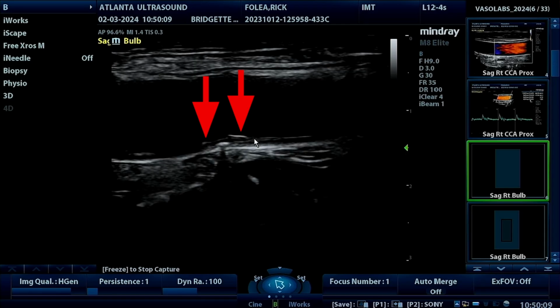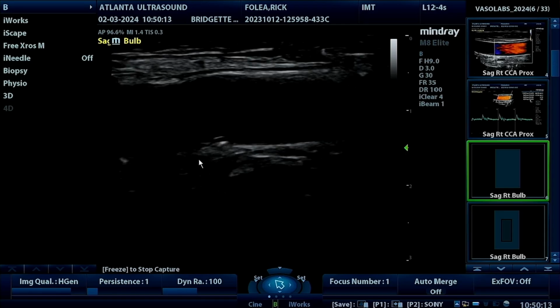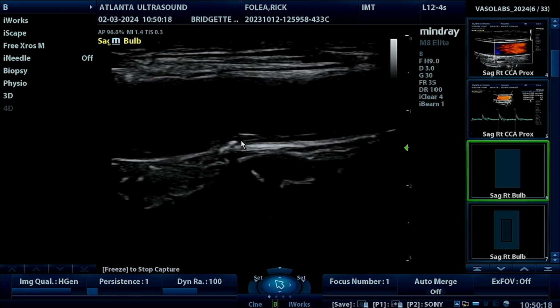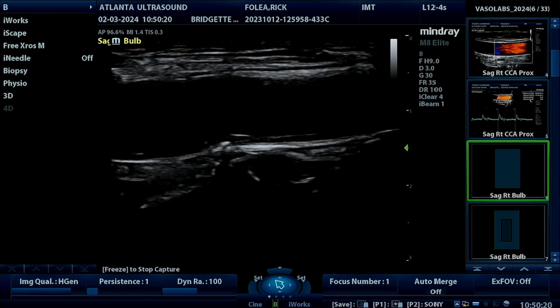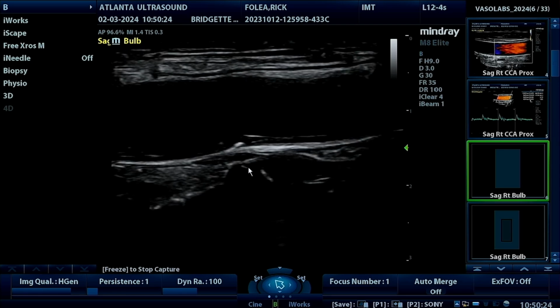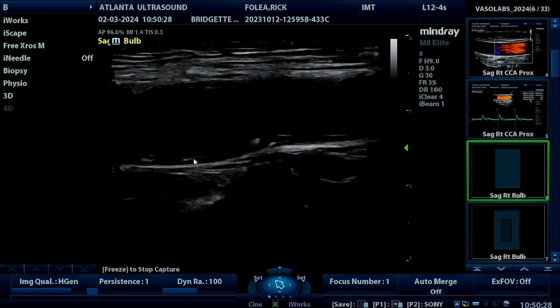These little plaques aren't casting a shadow, so we know these are more heterogeneous or mixed plaques. Or, I suppose it could be where the intima is starting to scab over and form a fibrous cap over the damage. Regardless, we definitely see the intima and media layers getting thicker, which tells us we definitely have plaque here. Not good news. Let's move farther up into the bulb.